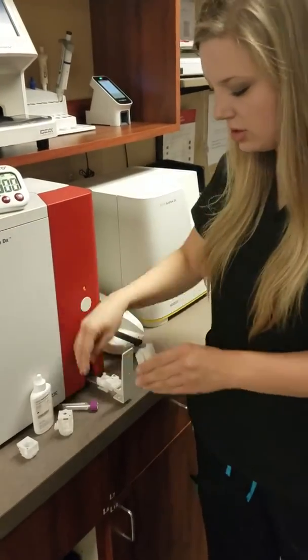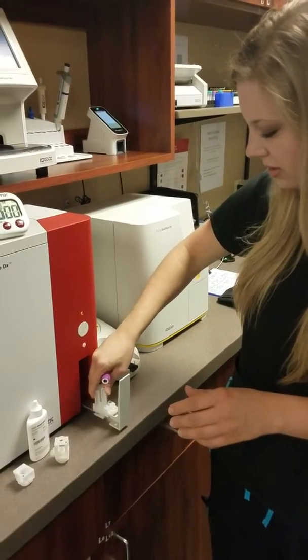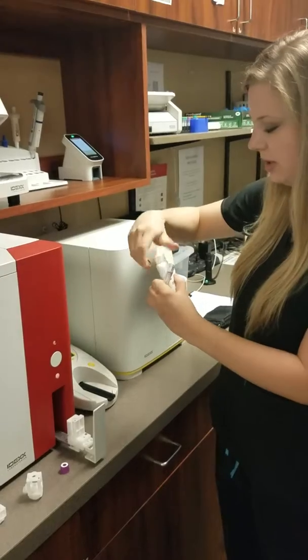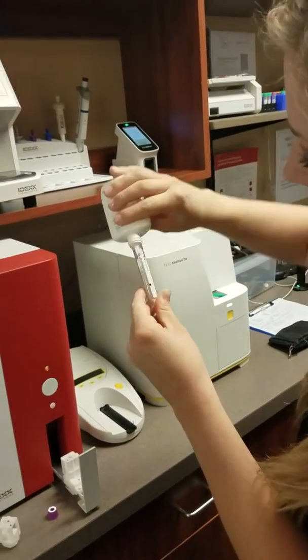I'm going to switch these two out. I'm going to fill up our tube with the rinse to this little black mark right here.